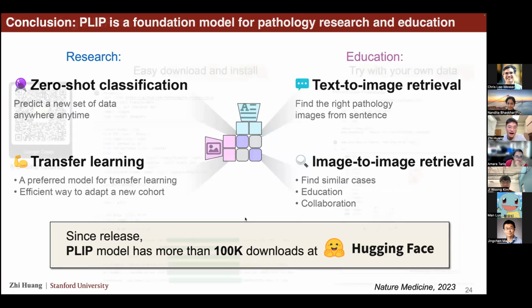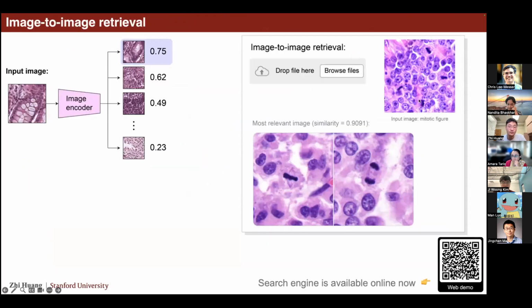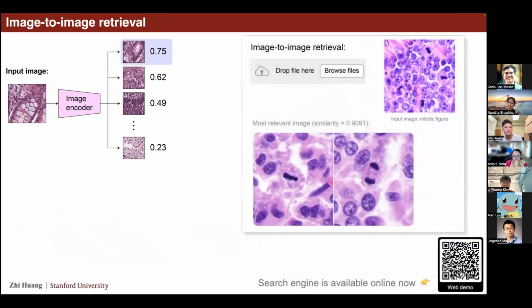I see. Yeah. So the question is about how we retrieve the image and how we rank those images, right? Yeah, but basically some metrics you can definitely match, but in the clinical domain, when you give an image and want to see a similar image, how do you quantify that it's similar, in kind of disease or appearance or severity of the disease, even outcome?